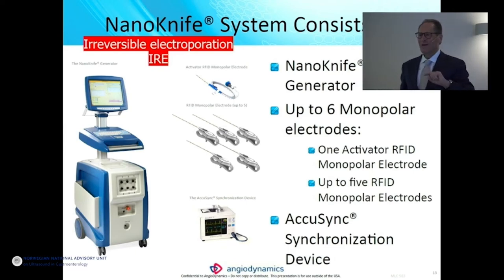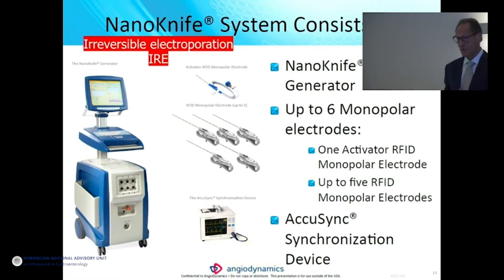So let's jump to another. This was microwave ablation, and it is very good to use CEUS and fusion. In straightforward cases, you don't need it. If you see the lesion, go ahead and do it. You do need CEUS, though. When you are done, you have to check that the ablation is done. Back to the ward. Another ablation system is what we call NanoKnife.